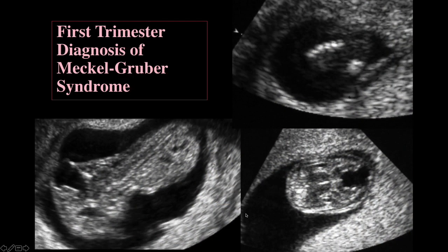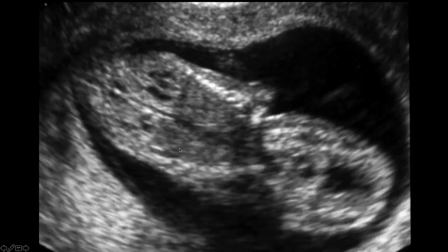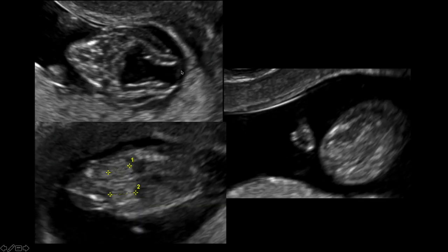Now, talking about Meckel-Gruber syndrome, this was an 11-week fetus that I saw with Meckel-Gruber syndrome where we made the diagnosis de novo. This patient didn't have a prior history, but you can see the encephalocele right here, which has got some fluid in it, typically with Meckel-Gruber, and then the extra digit. And you can see the cystic kidney right here, which of course, once you figure out what you're dealing with, you can actually piece it together.